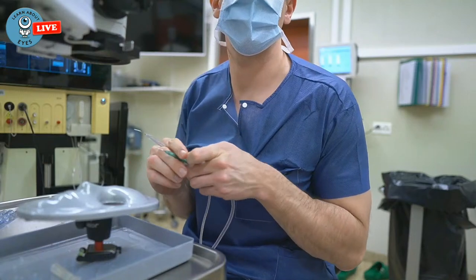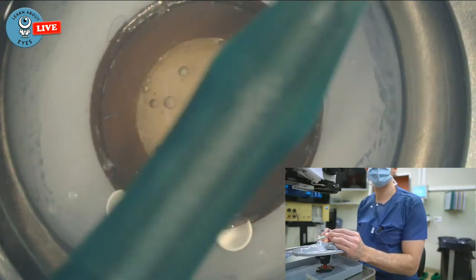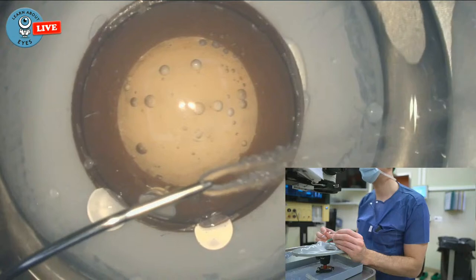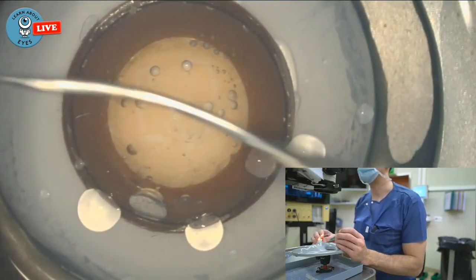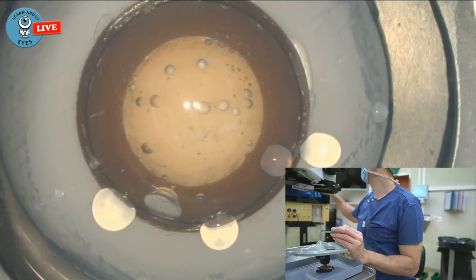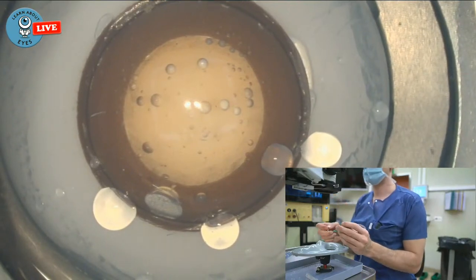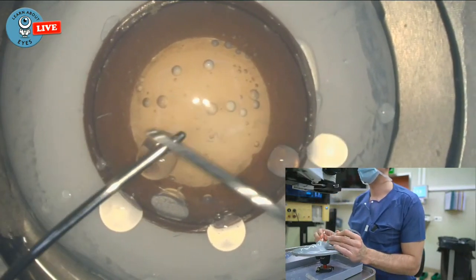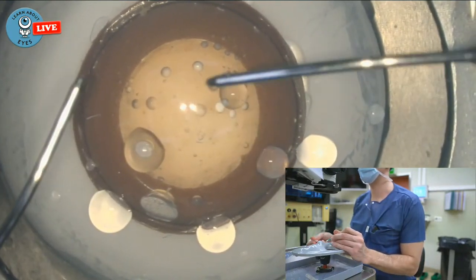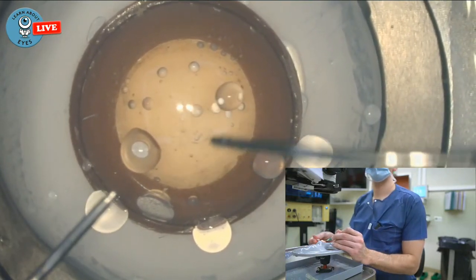And then just go into the eye like that. Now with Oertli it's easy. Green is always irrigation, so coming out here, and white is aspiration. This can be different for different firms. Okay, so. And how you can tell, usually irrigation has two holes on the sides, while the aspiration only has one hole on the top, this part. Hope you can see that.